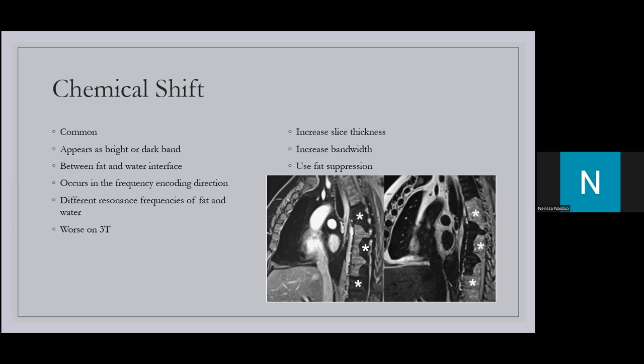The second type is caused by dephasing of the fat and water protons, and it basically causes signal cancellation.